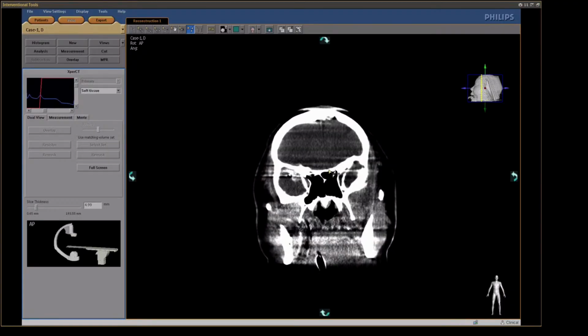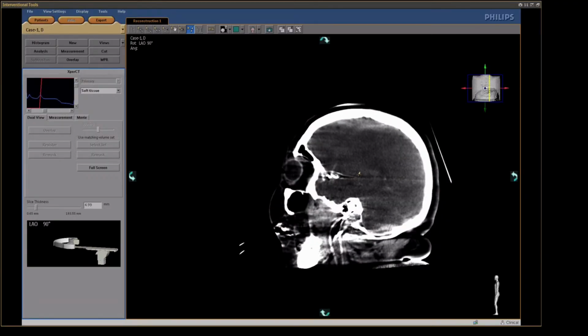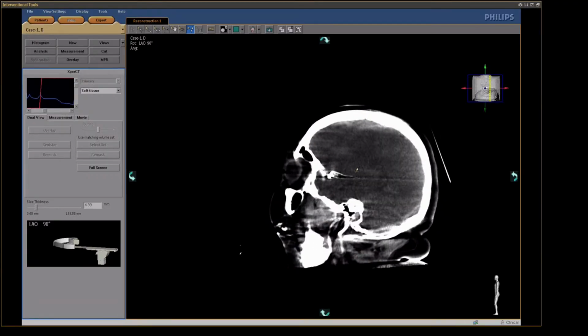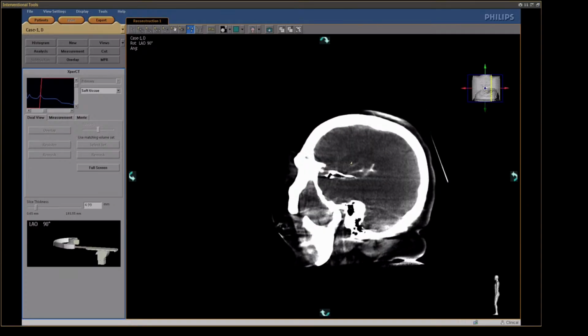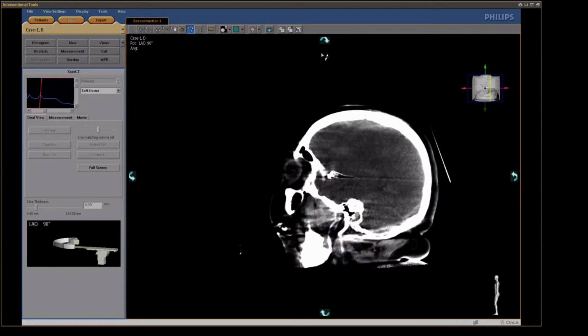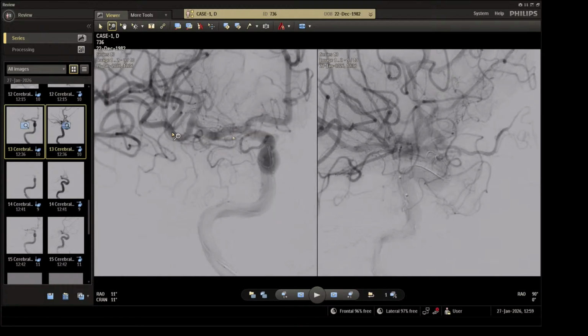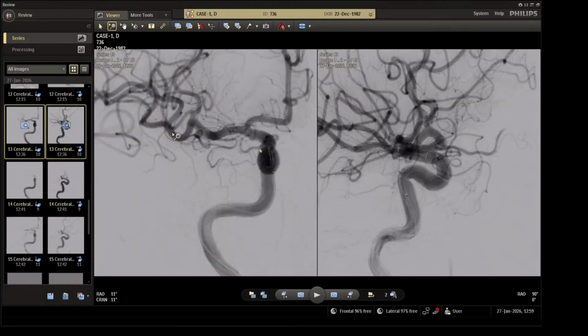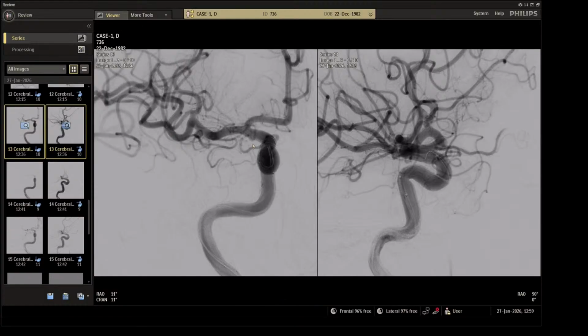Okay, this territory is, I have some questions. Huh? Oh, there is no hematoma, it's a subarachnoid space. Oh. Just a second. Okay, we can discuss, no problem.